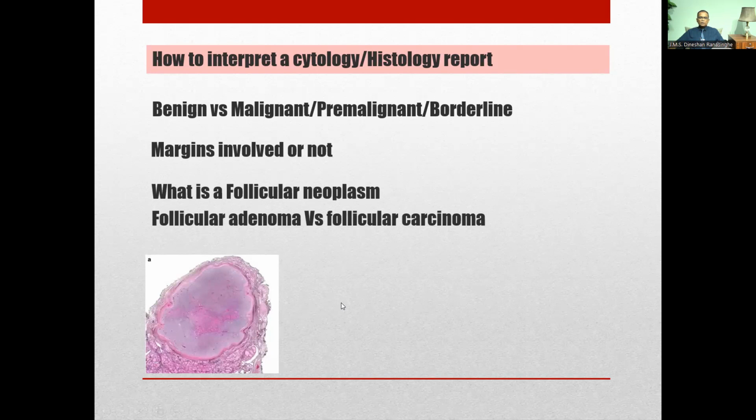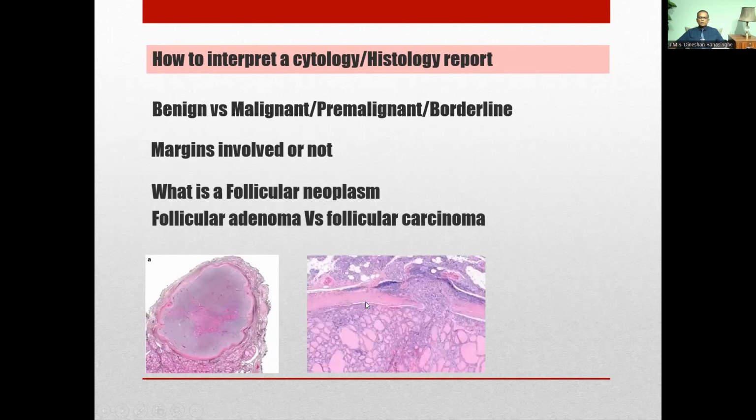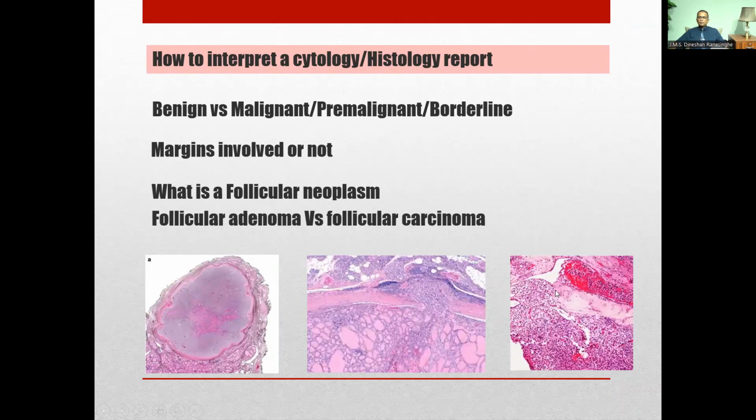And when it comes to follicular carcinomas, you are going to have an invasion. This is the capsule, you can see it. This is the site of the lesion. You can see it like a mushroom coming out. This is the site of invasion, the capsular invasion of the follicular carcinoma. At the same time, you can appreciate this is a blood vessel here, and the lesion is here. This is made up of follicles, and it is invading, and tissues can be seen inside the blood vessel.